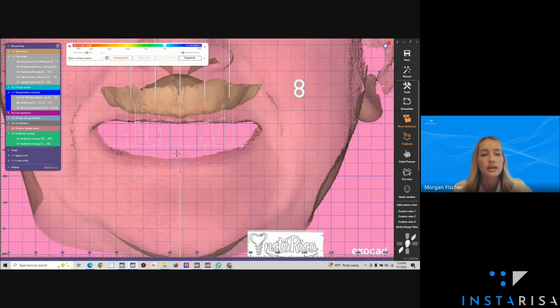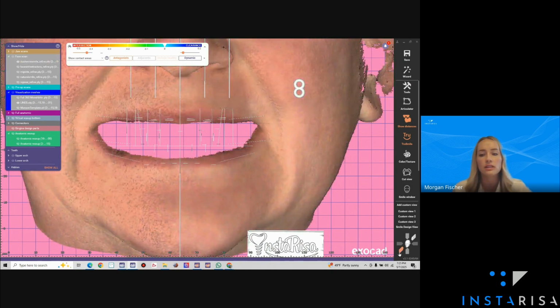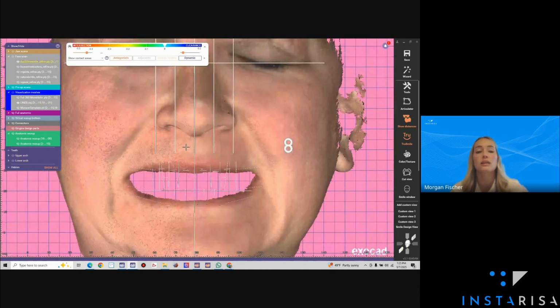So I decided on my incisal edge position. Another thing I'm looking at here with my incisal edge position is when the patient is in Duchenne in this high smile line, I'm not seeing a gummy smile. If she was smiling and we were seeing 2 to 3 millimeters above the zenith of the tooth there, maybe I would raise my incisal edge position. So everything is just constantly balancing these things.